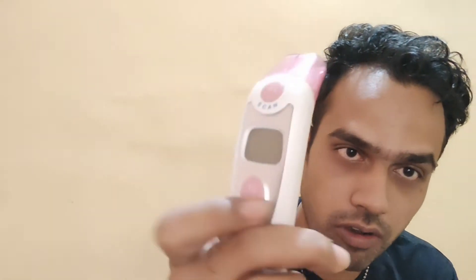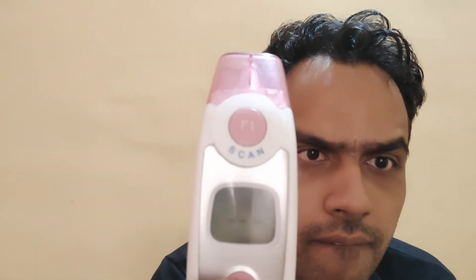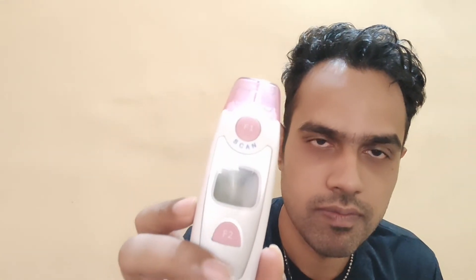Now if we want it back in Fahrenheit, we follow the same procedure. When the thermometer is off, press the F2 button and hold long enough until you see the Celsius symbol. Then press F2 again and it changes to Fahrenheit. Let the thermometer turn off again, then take the temperature — this time it will record in Fahrenheit.